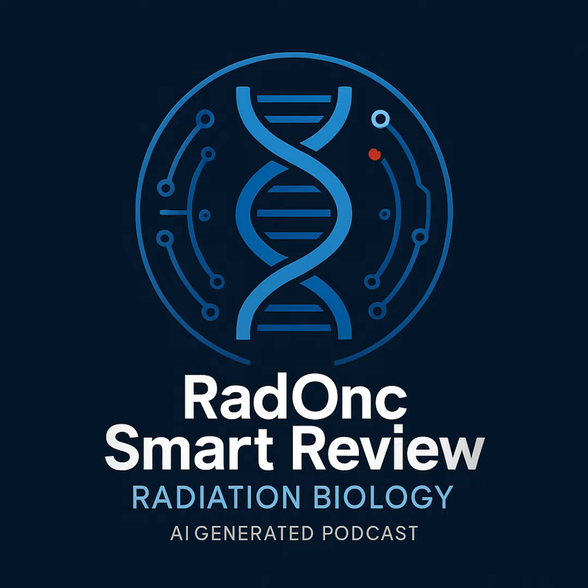We'll talk about those in a second. Yeah, 18F is king. What else? Then you have the short-lived ones that pretty much require you to have a cyclotron right there on site. Carbon-11, 11C has about a 20-minute half-life, used for things like 11C methionine or 11C choline.